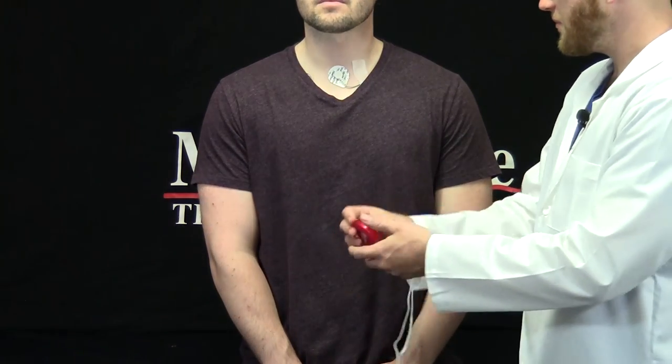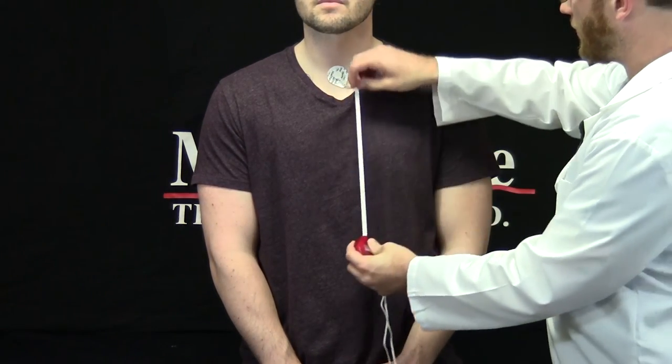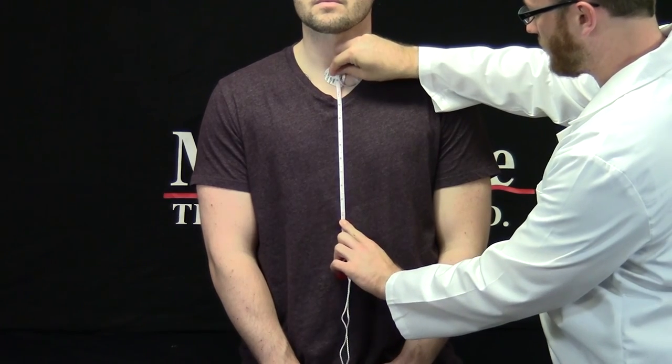It's important for certain statistical analysis of cardiac impedance to know the distance between the sense electrodes on the subject's chest. I'm going to take my measuring tape and measure between the center of the sense electrodes, and I'm going to record this value for future use in the impedance analysis application.